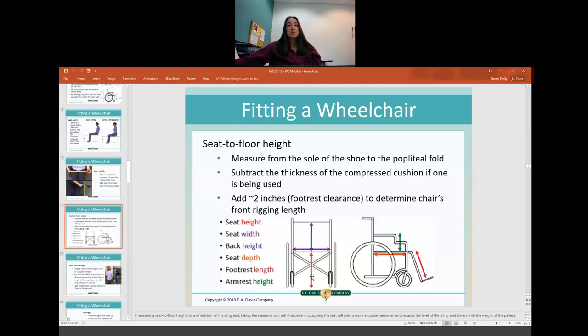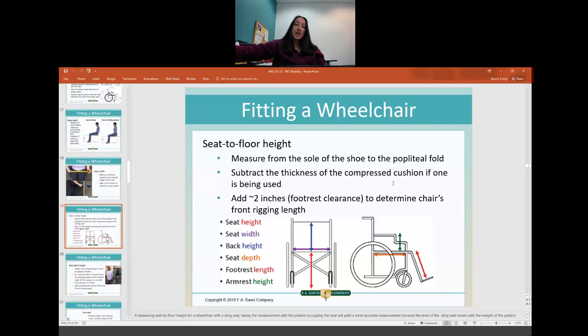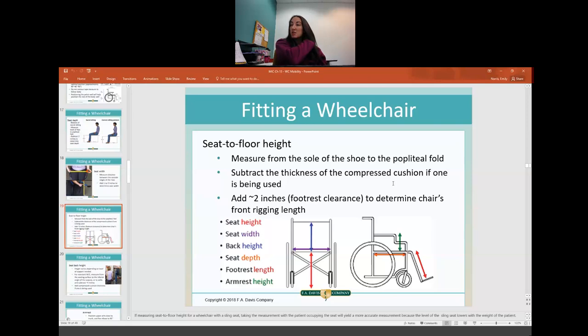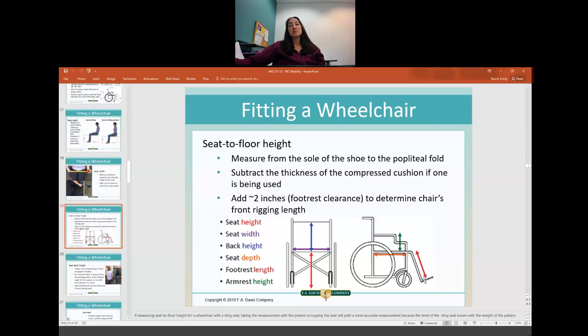For seat-to-floor height, you measure from the sole of the shoe to the popliteal fossa, then subtract the thickness of the compressed cushion. Whenever you're using a cushion, you want them sitting on it and always subtract the height of the cushion once they're sitting and it's compressed. Then you add 2 more inches to ensure good foot clearance underneath the footrest.